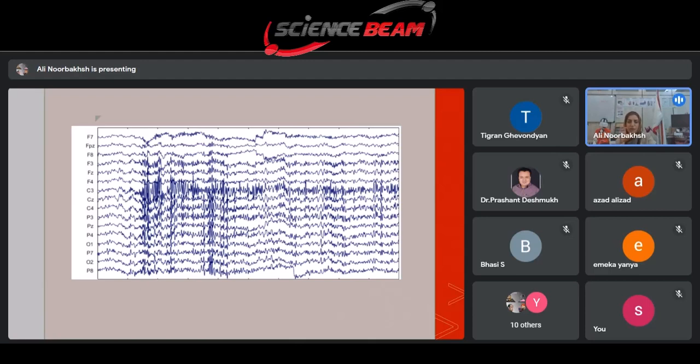It looks like a beta wave. So when you want to record a signal, you should say, please open your mouth.